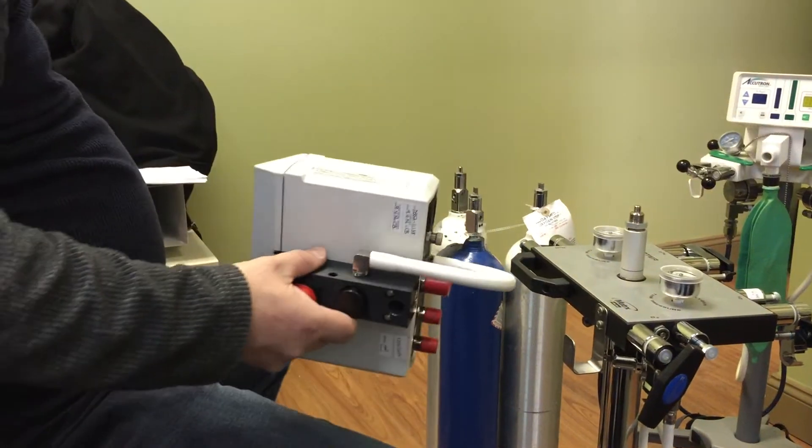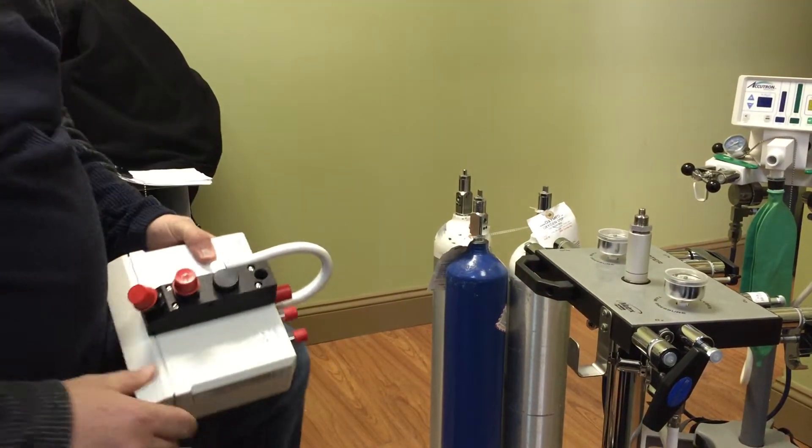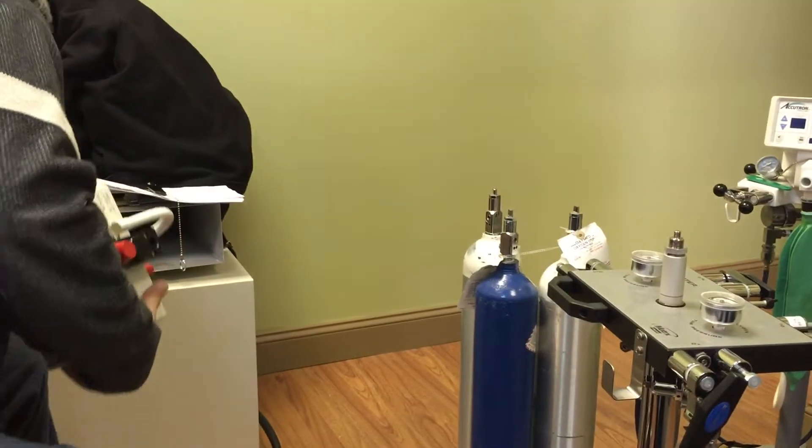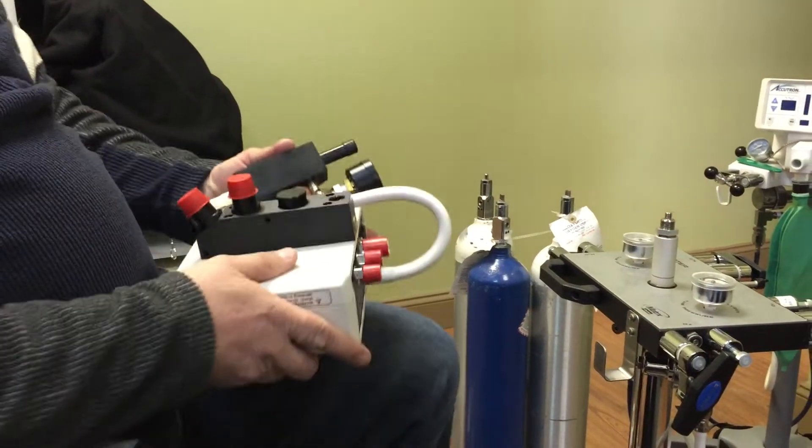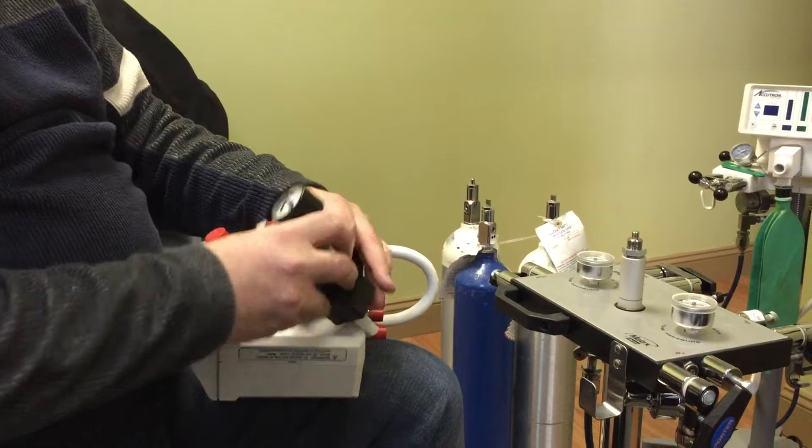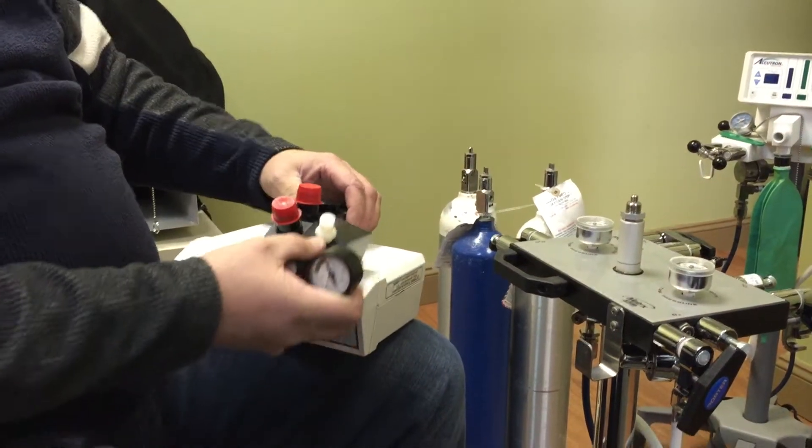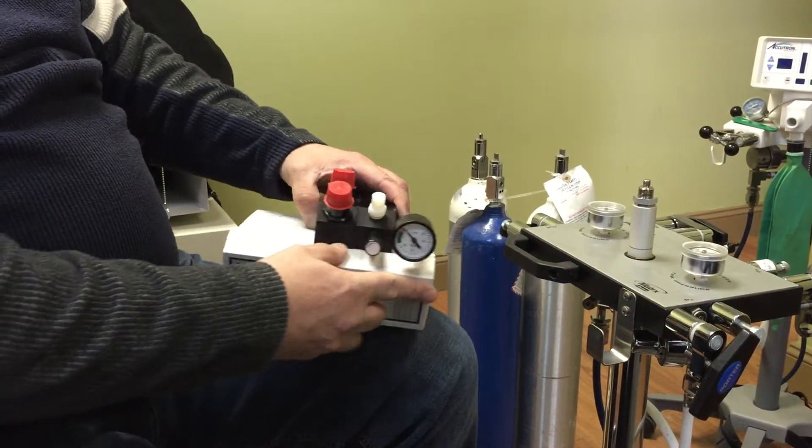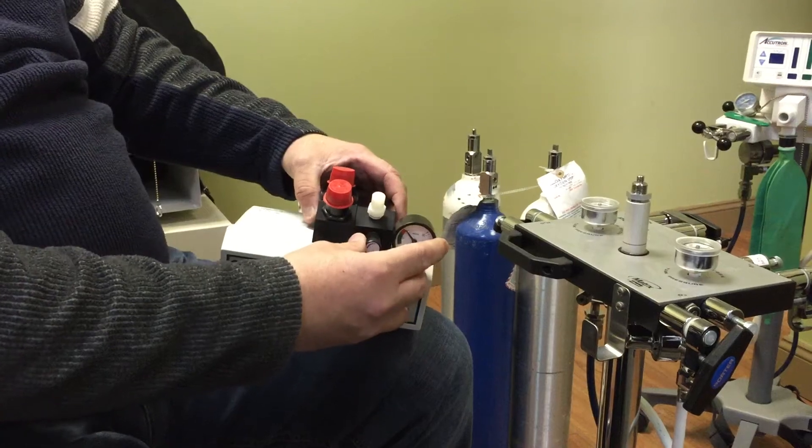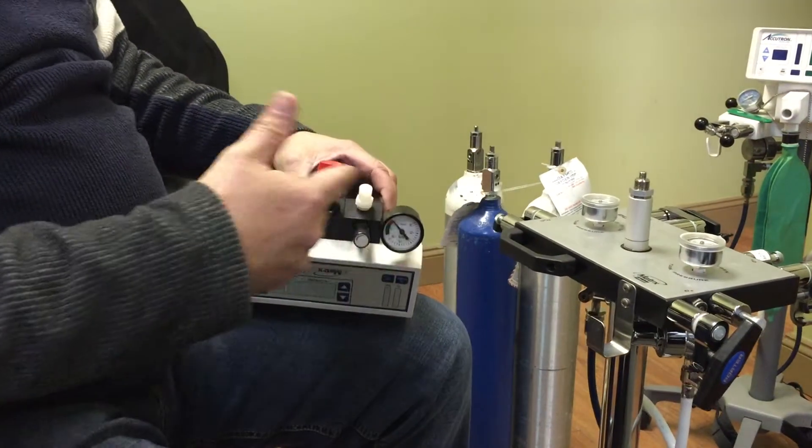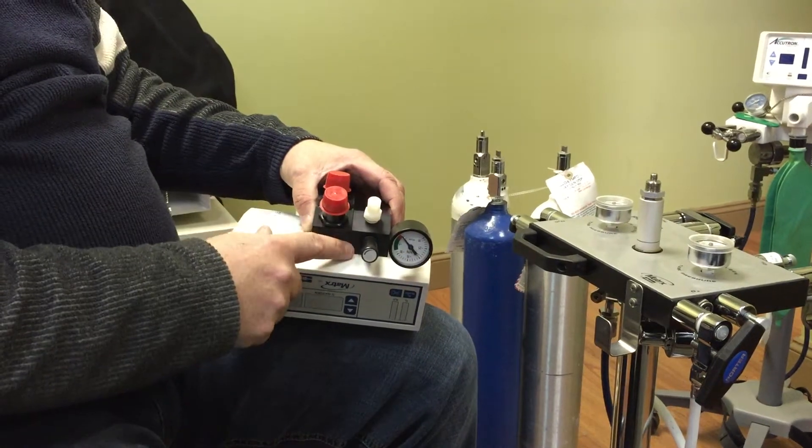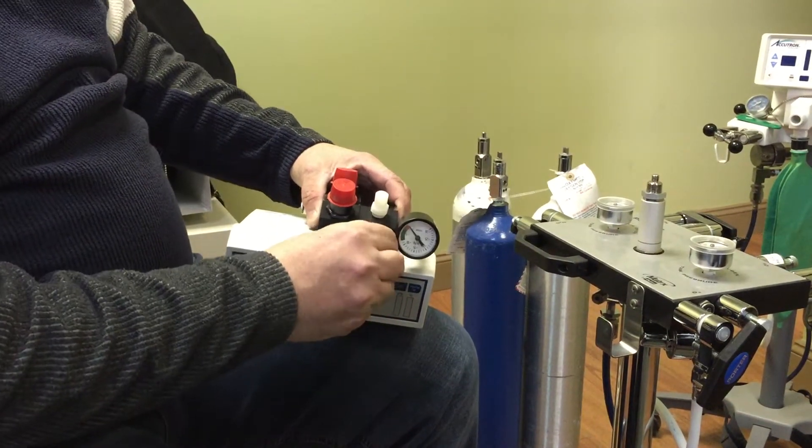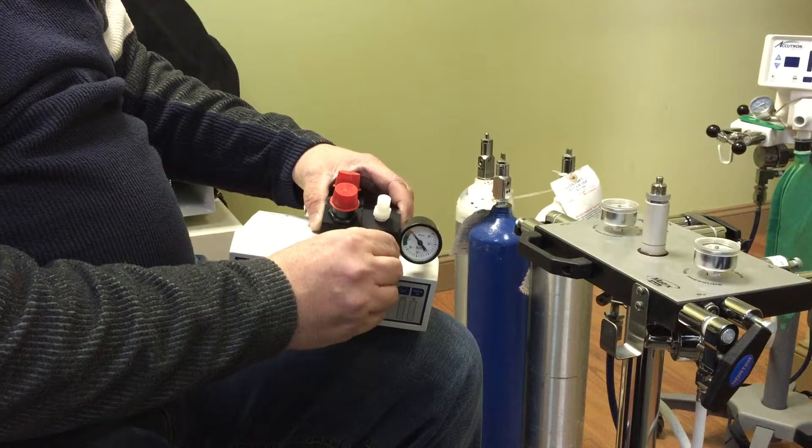So when assembling this, it's always good to actually put on your scavenger control block. Now this sometimes is sold as an option. Most of the time they come with it, but this mounts to the side of the unit. What this does is actually controls the amount of vacuum that's going to be delivered to the nasal hood.